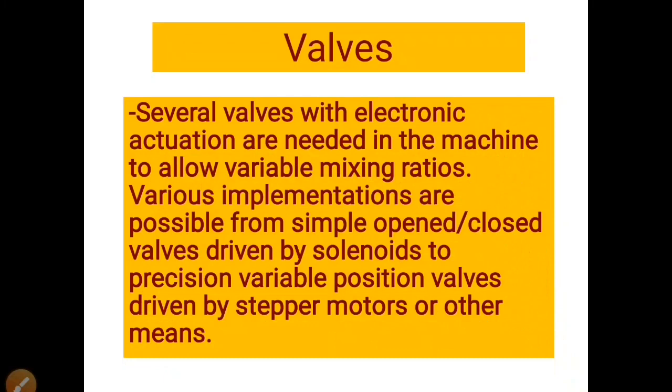Next we will learn about different types of valves. Different types of valves are used in this process, as we can see, for controlling pressure and for detecting air bubbles. In many cases in this dialysis machine, valves are very important for controlling the whole process.